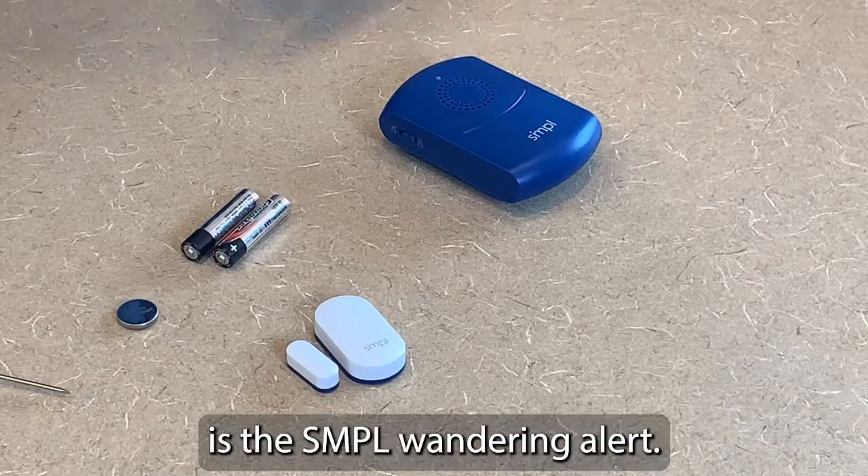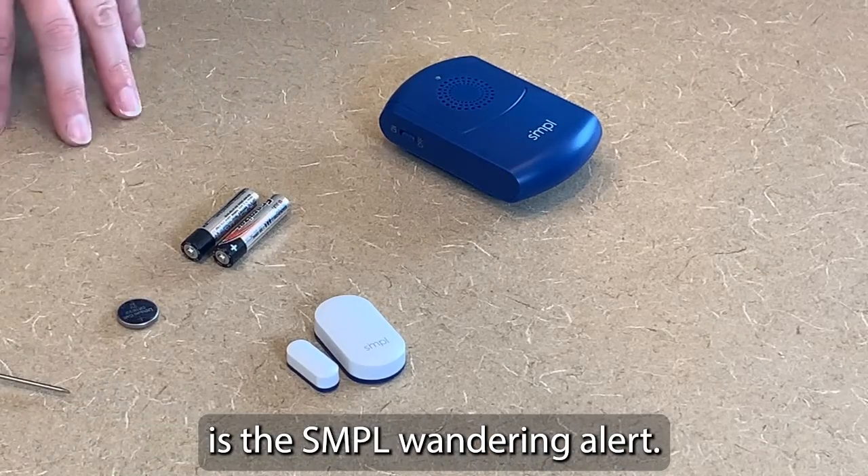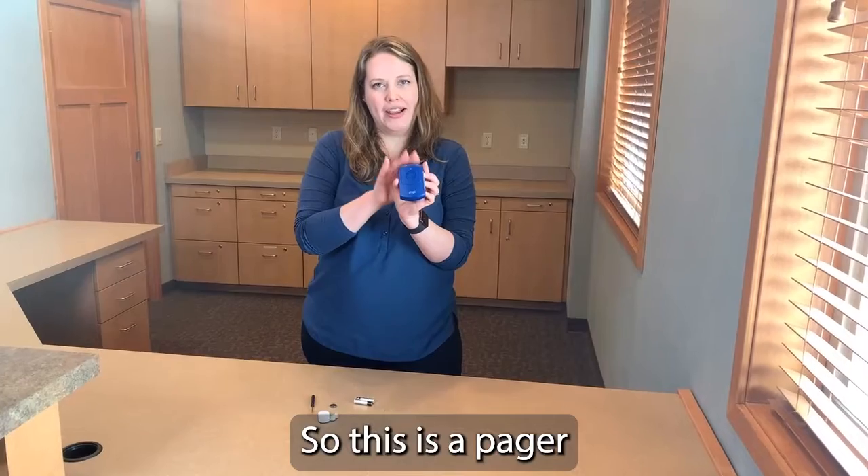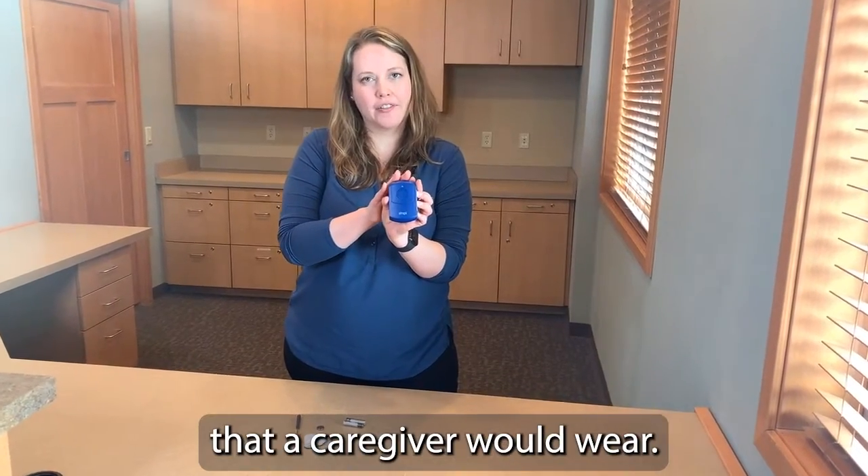This little device is the Simple Wandering Alert. This is a pager that a caregiver would wear.